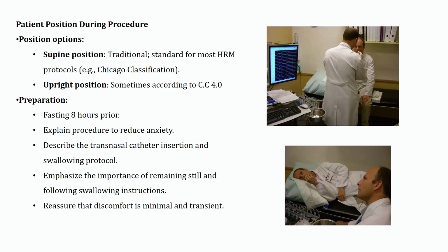Okay, go ahead. In general, we usually make the insertion of the probe in the upright position. All of this talk now will be for both types. The insertion will be in the upright position. It is from the nose. It is almost the same as inserting an NG tube.